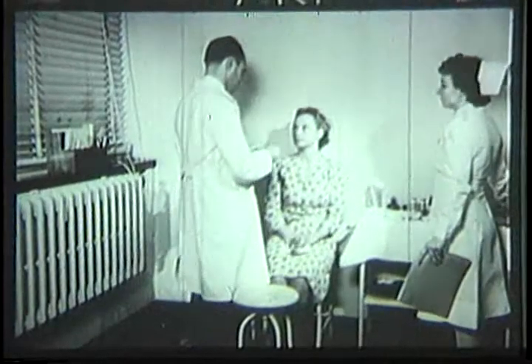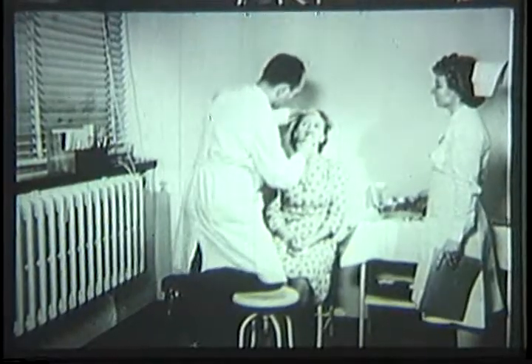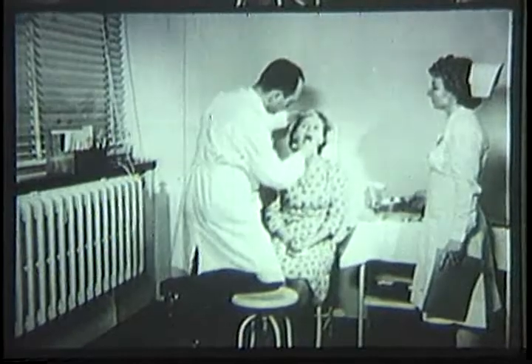Mrs. Gordon's carcinoma responds well to a few weeks of treatment, but a hard core in the center of the tumor remains. In order to destroy this core, the external X-ray radiation is to be supplemented with interstitial radiation, radiation coming from within the tumor. That means a prescription for radon seeds.